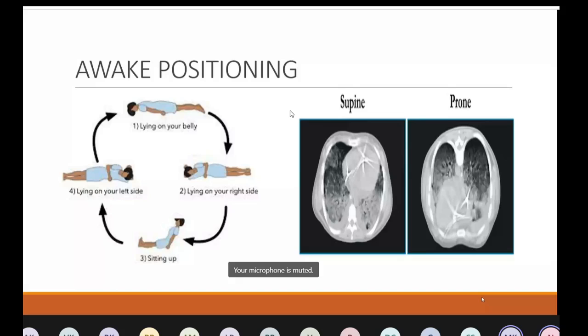So how will we troubleshoot? If our patient has persistent hypoxia, change from our BiPAP machine to our NIV ventilator, increase your EPAP or your PEEP, look for positioning. The main reason why your patient is in hypoxia may be that you have a leak. So adjust the leak. Most commonly, in the last 1 week I was in COVID, we had very sick patients on NIV, and we have seen these leaks. Once you really troubleshoot the leak, the hypoxia actually improves. And if it's still not improving, go ahead and intubate the patient.